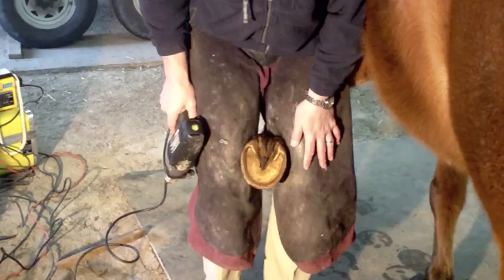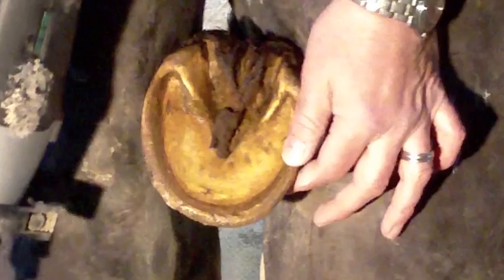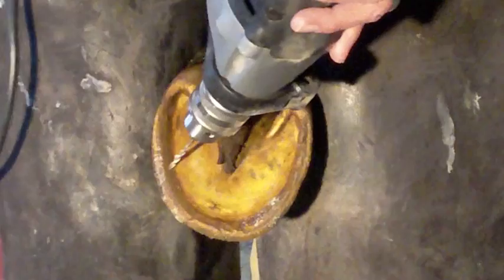You might be wondering how we're going to apply this wooden shoe to the horse's foot — there are no nail holes in the clog. We're actually going to screw a couple of screws into the hoof wall and into the shoe to help stabilize it. To make sure I'm in the right place, I go from the back and make a small pilot hole. This way I know that when I screw from the top side down, I'm not getting into any sensitive tissue, and it helps me screw from the outside into the shoe.